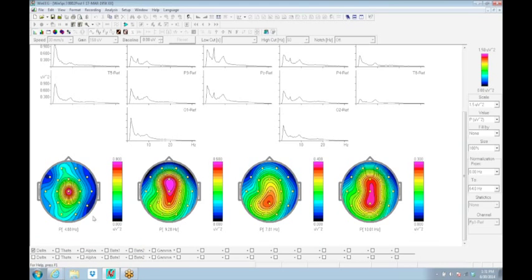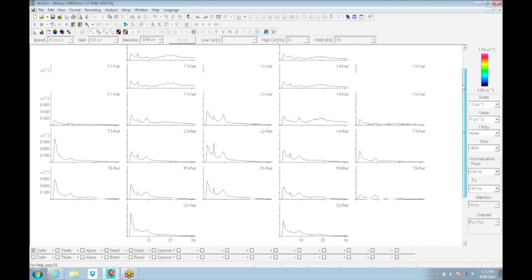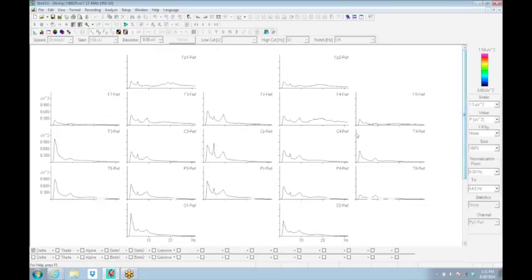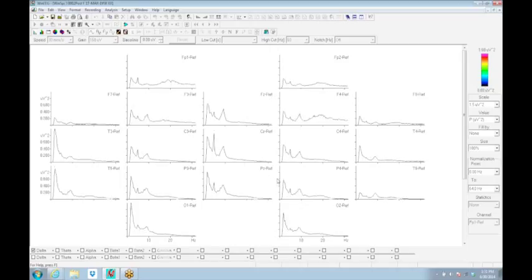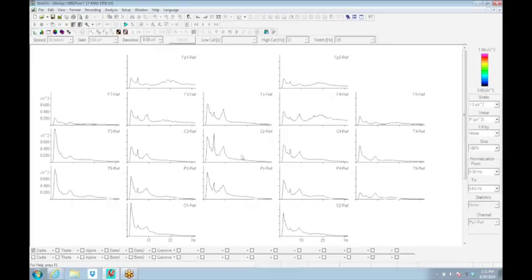I think they're somewhat useful in trying to show something as being localized or focal in some circumstances. But they can also overdo the focus. If you've got something that's generalized but it's maximum in a spot, you can end up with a map that overdoes a focus. You've got to make sure that you go back to the raw data, not just your maps. These are the raw spectra as they were pulled in. These raw spectra had various frequency components to them.